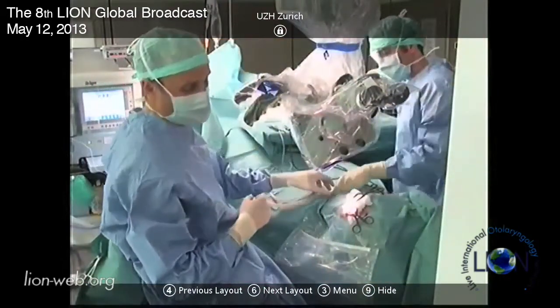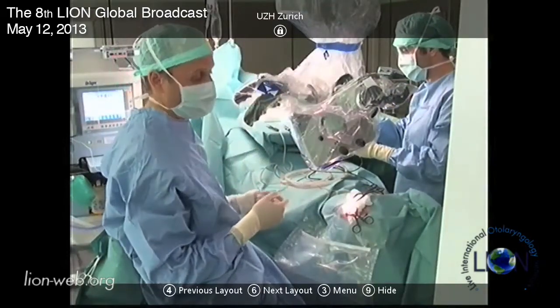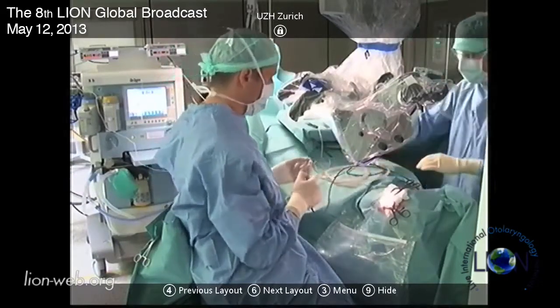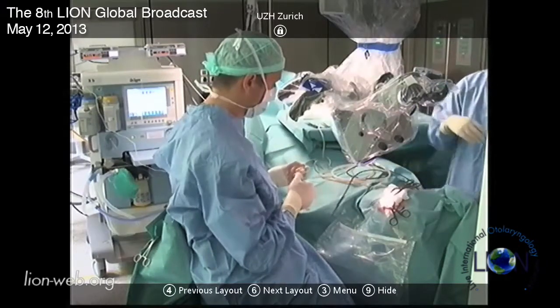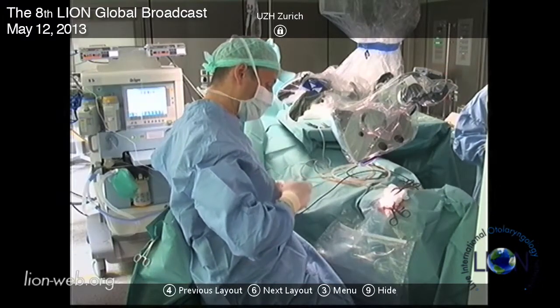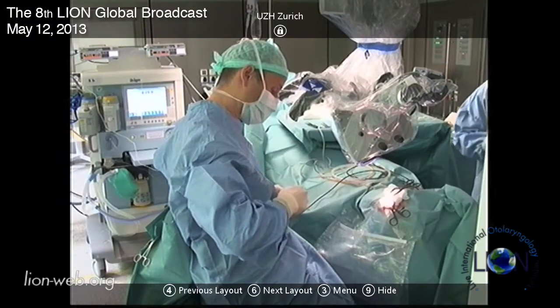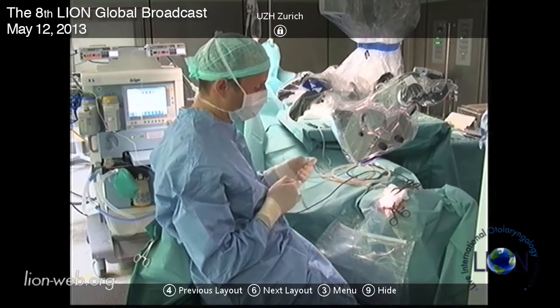Now I use the osteostep - this is the B&A drill, 0.6 by 4.5 - and I use the osteostep to make a nice round hole. It's a wonderful drill but you really need to make sure the burr is properly seated. I sometimes have difficulties inserting it. It's a fantastic drill but just this bit is a problem - for some reason it does not want to go in today.